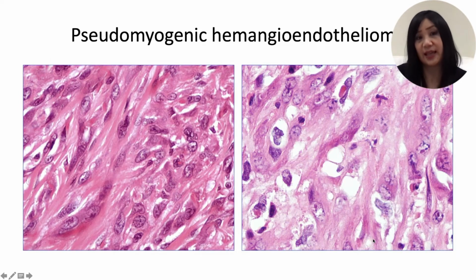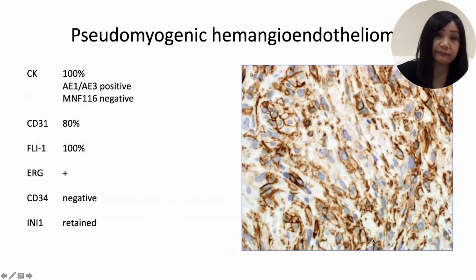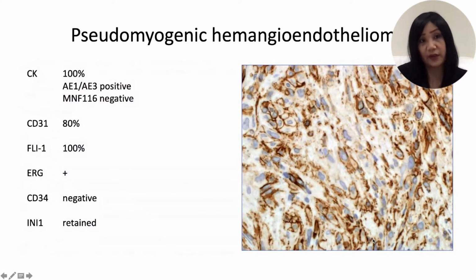And here we can see, again, the plumpiness, a somewhat fibrohistiocytic looking morphology of the cells, and a cell that is attempting to form an intracytoplasmic vacuole, i.e. rudimentary vasoformation.